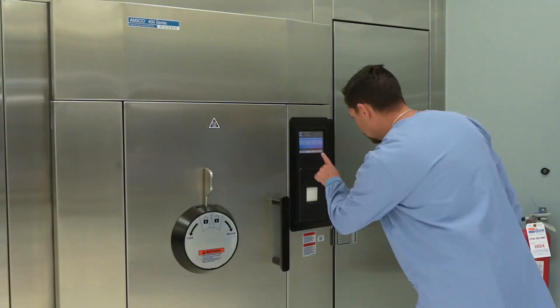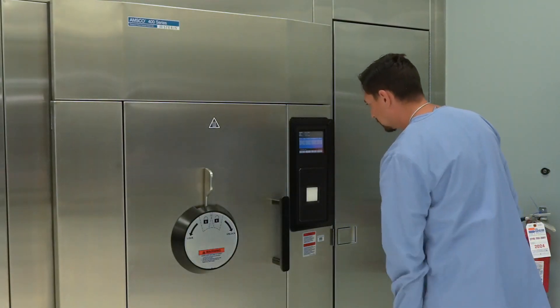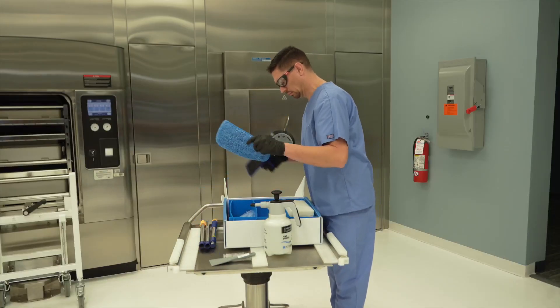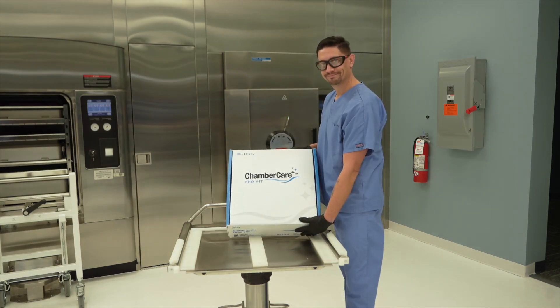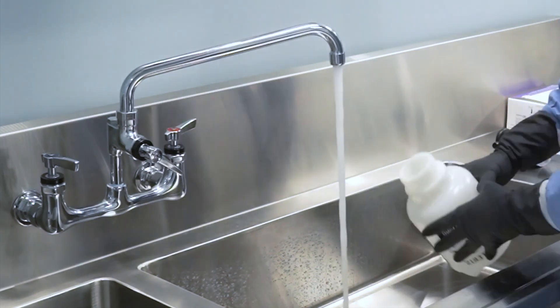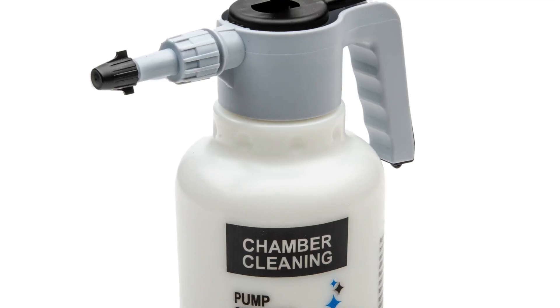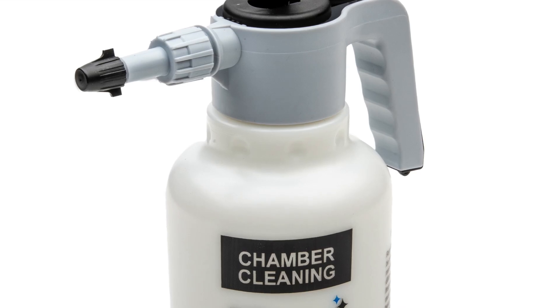Step 15: The drain strainer should also be cleaned following chamber cleaning to remove any debris resulting from the cleaning process. Step 16: Replace the sterilizer rack and shelves if applicable using the reverse of the removal procedure. Step 17: Return the unit to operation. Step 18: Run a warm-up cycle followed by a DART air removal test cycle for flushing and testing purposes. Step 19: Clean up the area you are working in and put all supplies back into the Chamber Care Pro Kit box. Steps 20-21: Rinse the pump-up sprayer thoroughly, empty the water, and store containers in a manner that promotes drying until needed for further use.